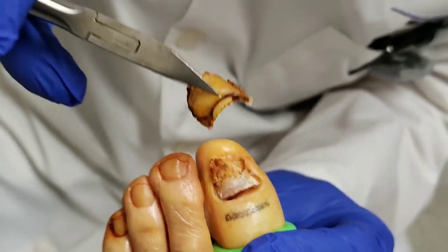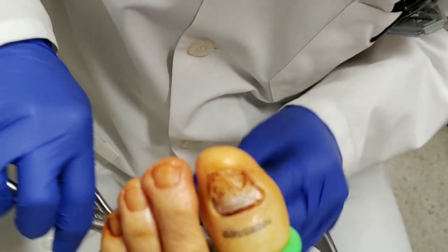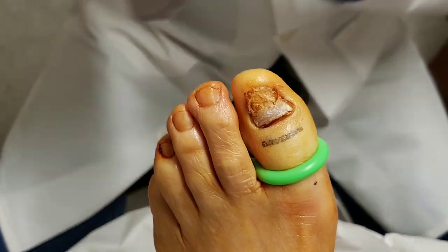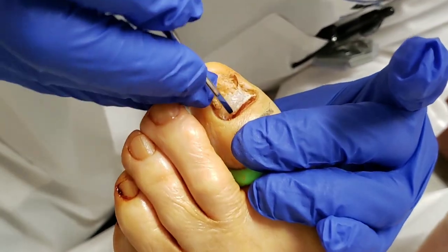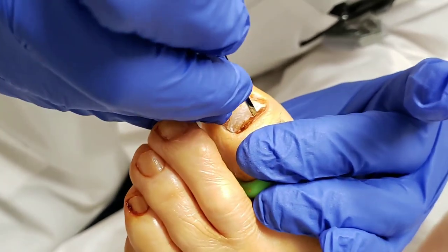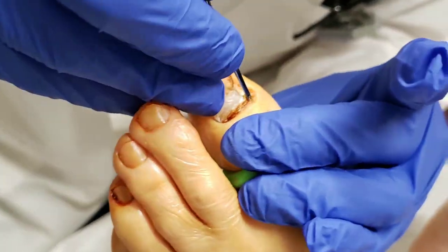And so that's how the nail came off. Now there's still a lot of other debris underneath there. There are a couple of ways of doing it — you have to get all this debris. I think there are layers of nail actually. I don't think that was the whole nail; I think that was the first layer of nail.